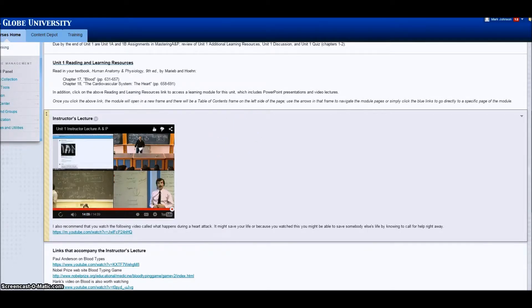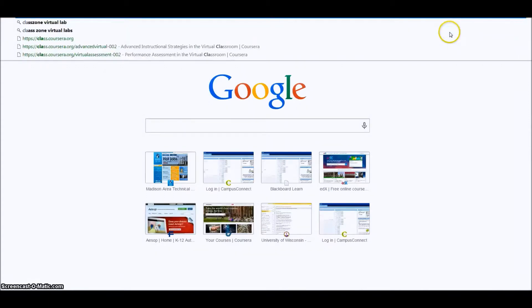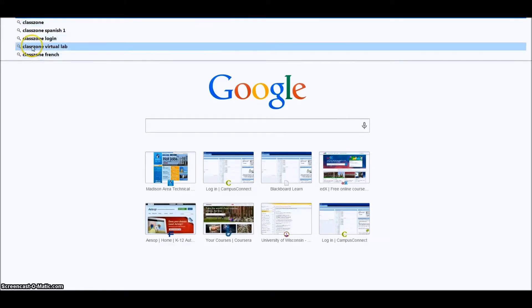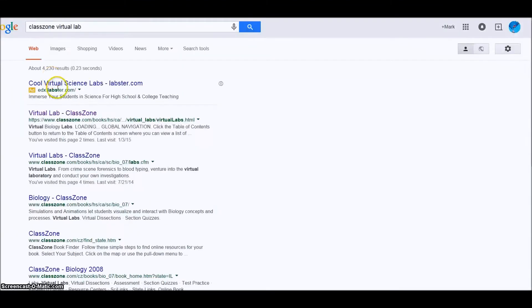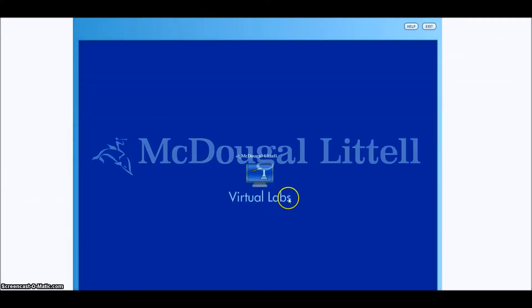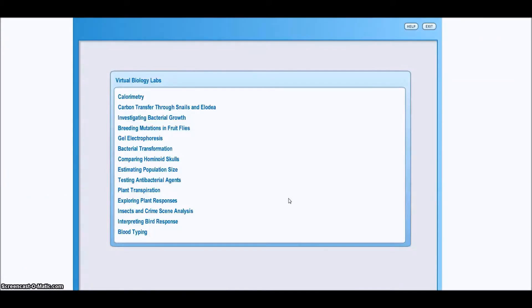I'm going to put into my browser ClassZone Virtual Lab, and McDougall has these virtual labs. I'm going to click on Virtual Lab ClassZone, and there McDougall is coming up.